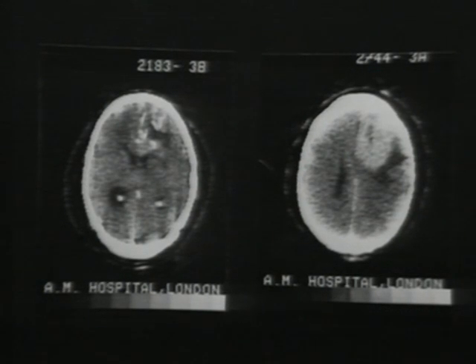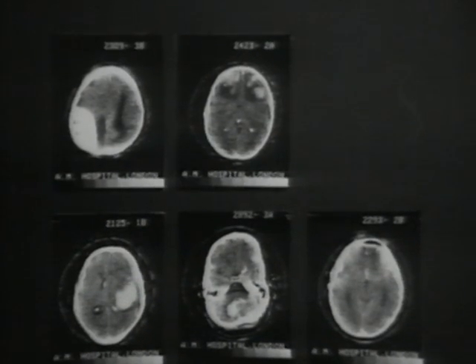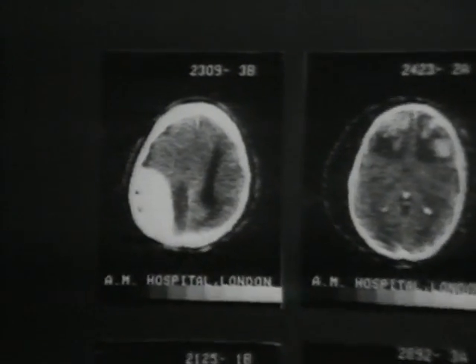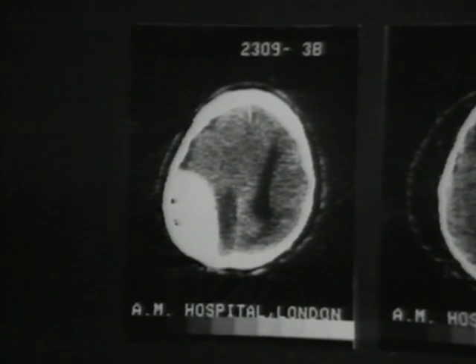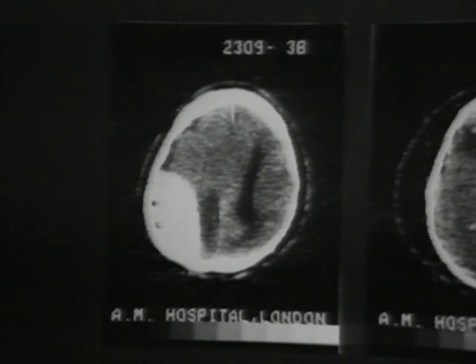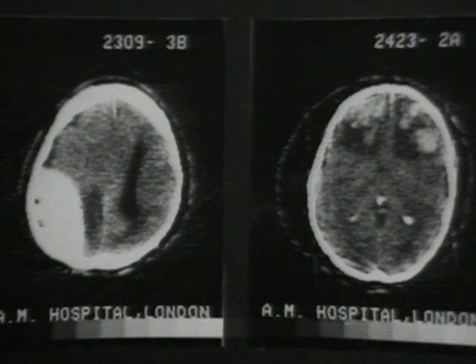Other lesions containing calcium are equally well shown. In hemorrhage, once clotting has occurred, serum is progressively absorbed and the concentrated blood constituents will then have a much higher average absorption value than normal brain. Absorption values for hematoma may vary from plus 22 to plus 36 depending on the amount of serum absorbed. This large difference in absorption values between hematoma and normal brain enables the computerized scan to operate to great advantage in craniocerebral trauma, or indeed any condition where a hemorrhage is suspected and the hematoma requires to be delineated.